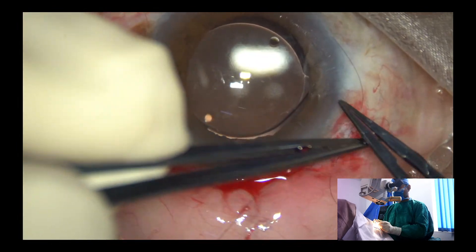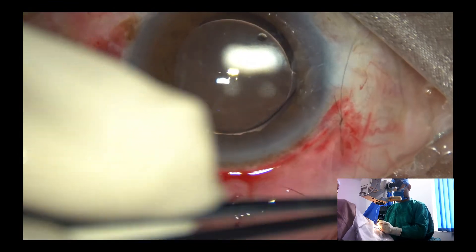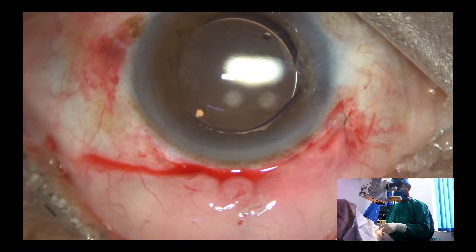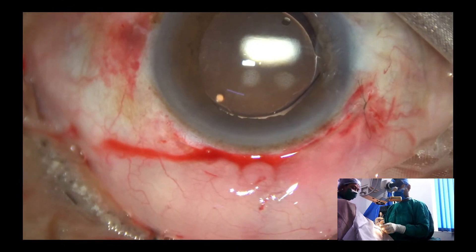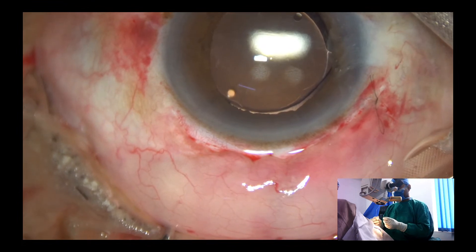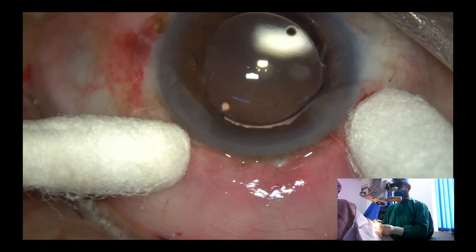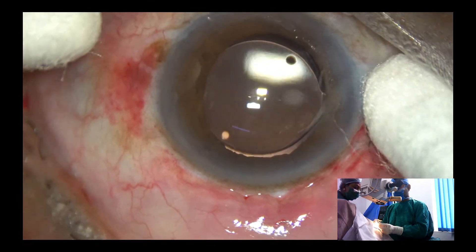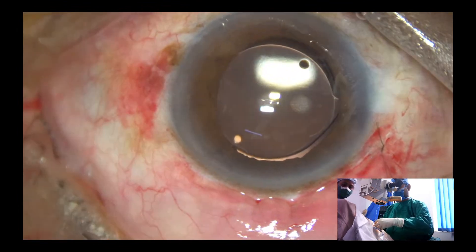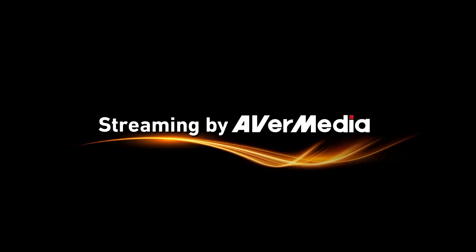One, two, three locks. Now we check the position of the conjunctiva — the conjunctiva is going to be nicely opposed to the limbus. The anterior chamber is clear. And here we conclude the case. Thank you very much for your attention.